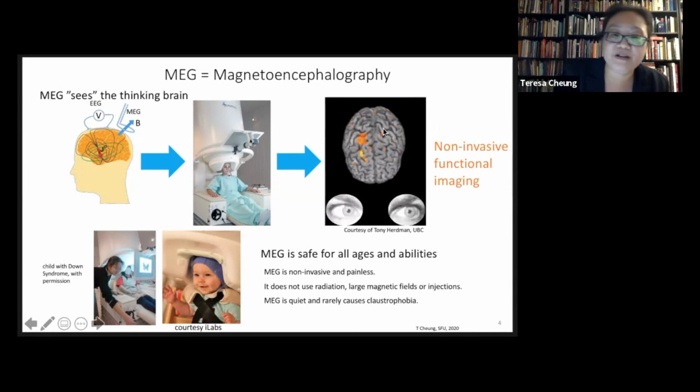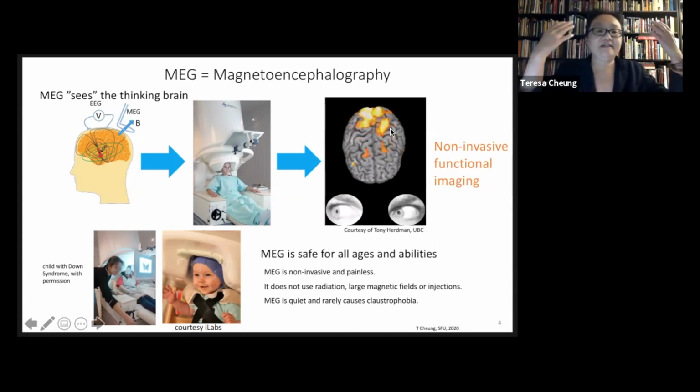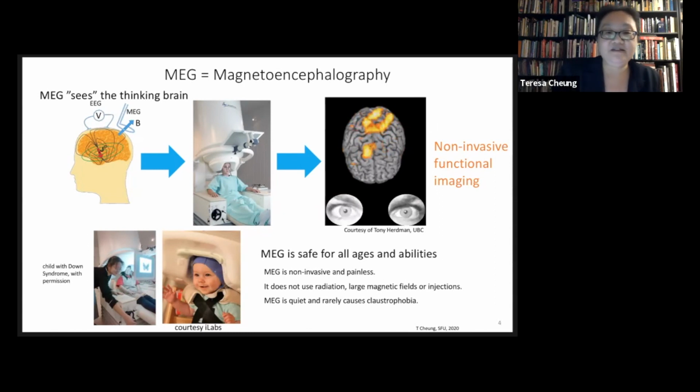And so this diagram here shows you an example of what you might see when you place your head inside an MEG system. In this example, what we're measuring is someone's eyes moving back and forth. When his eyes move back and forth, his visual area resets, and what you're seeing is his visual area being reactivated every time his eyes move back and forth. The visual area, or visual cortex, is actually in the back of the brain, and this is shown here in this patch that's being activated when the eyes are moving back and forth. This, I think, really nicely illustrates the fast timing of MEG, that it is able to detect information from the brain at the speed of thought, as well as its capability of finding the location of where something is happening.